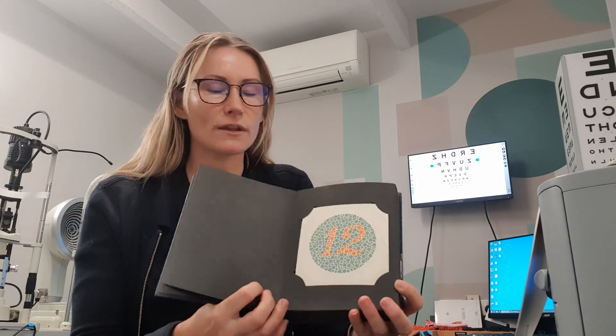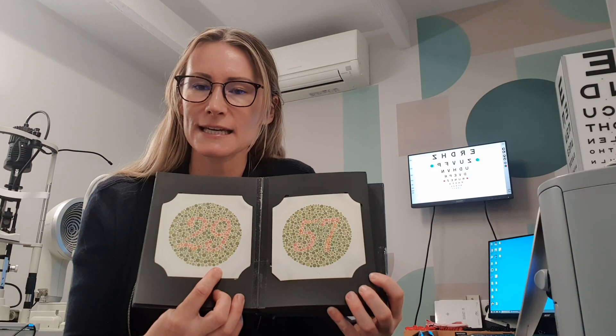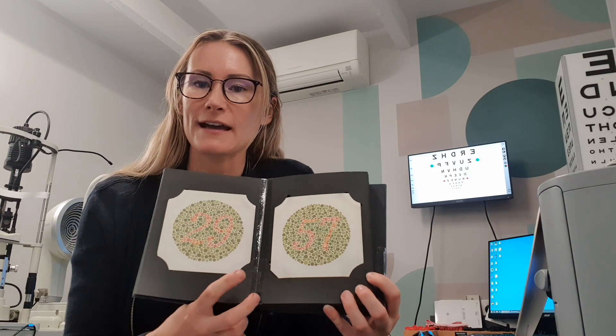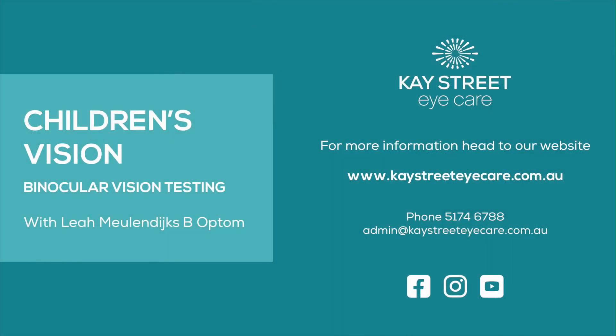Last but not least, we check the colour vision of the child using the Ishihara test. With these plates here, if the child can't see the number or sees a different number to what we would see, that can indicate that they have a colour vision problem. Thank you for your time. If you would like more information on children's vision testing, please see our website. Enjoy the rest of your day.